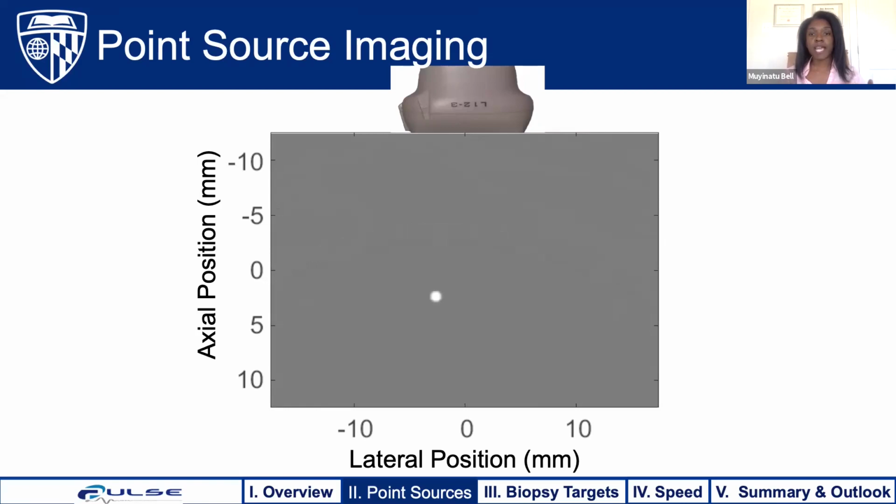But when we apply today's beamformers, we instead get something like this, where the shape that we would want to detect is distorted and the source appears at an incorrect depth, and we have artifacts to the left and right of the source. One reason we see these deviations from what we expect is because of fundamental flaws in the mathematical models that are used to create these traditional beamformed images.